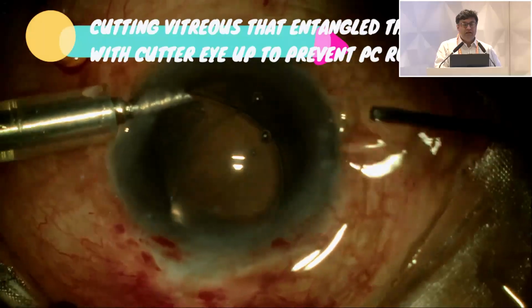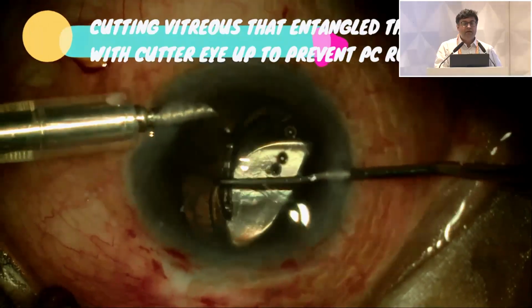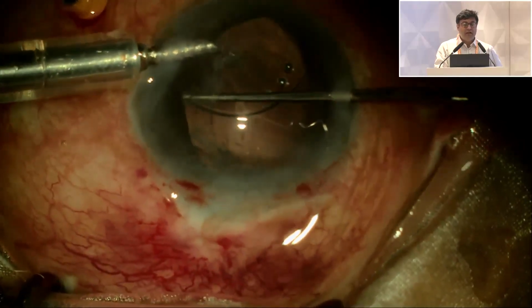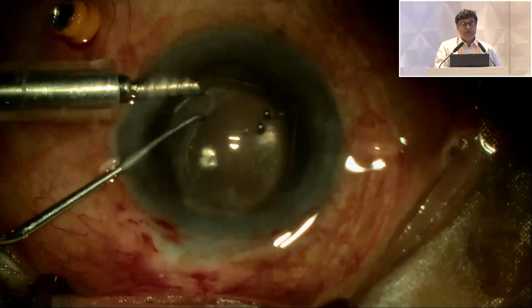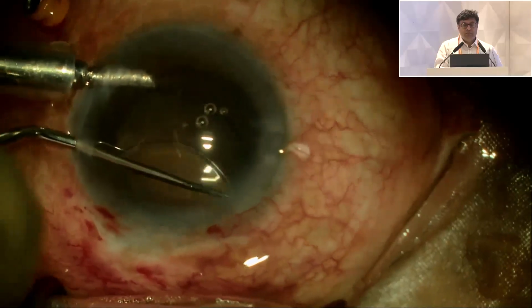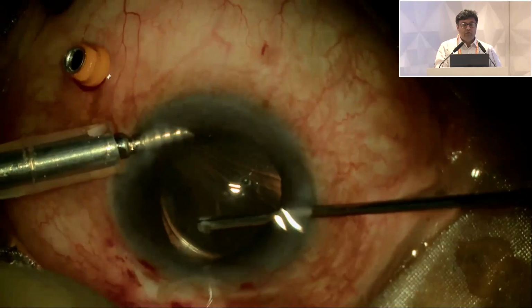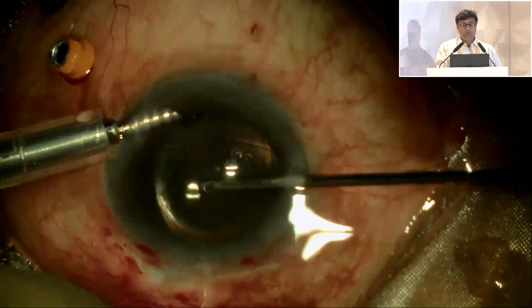Now, having done that, the lens is very well sitting in the sulcus, but I now needn't put it in the sulcus at all. I can actually put it inside the bag, and that is what I did. And that is how this was managed. The patient didn't have to undergo IOL explantation with a 3-piece implantation. I could manage with a 1-piece lens because I put it actually in the bag.